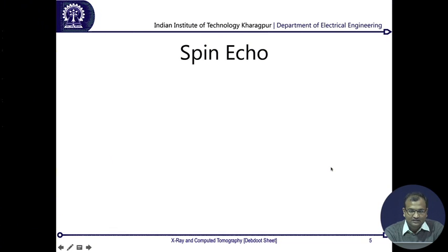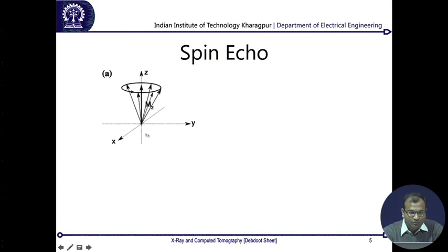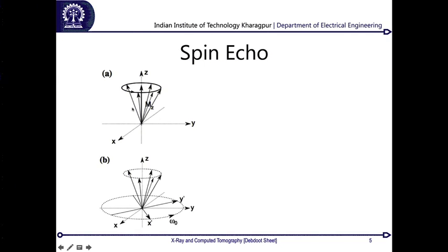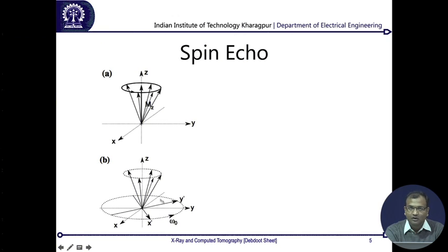Now from there, let us see what happens if we put in energy and then observe over a period of time. Say we put in so much energy that all the protons go to a higher energy configuration, aligned opposite to the magnetic field. After some time, just because of sheer thermal motion, they lose energy to other atoms, and eventually fall down to this plane, and then some of them again go opposite to each other, so that the net magnetic field is going to be zero.